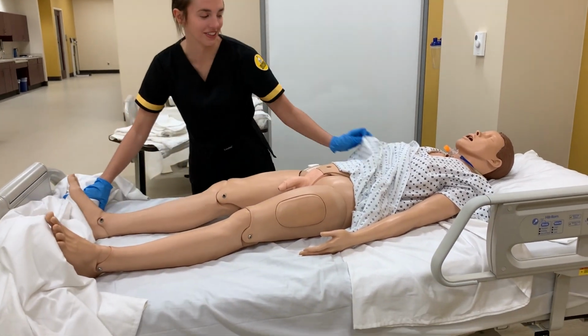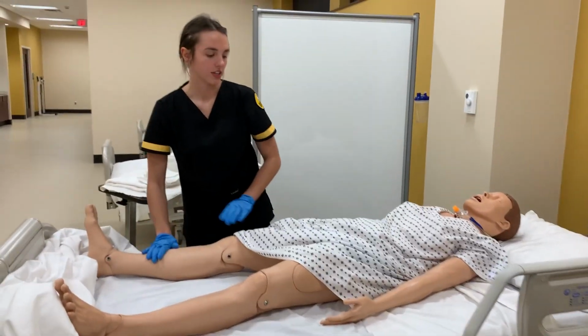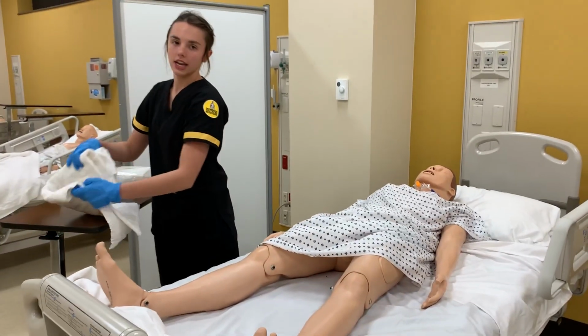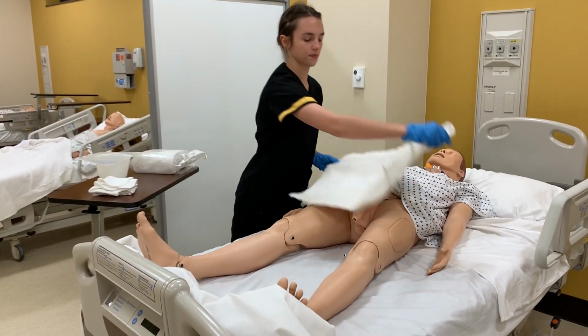Oops, so sorry. Didn't know that was up. So for this procedure, we're going to have your thighs spread apart. So we're going to go ahead and do that. And now I can go ahead and pull this back and put this towel up across you.